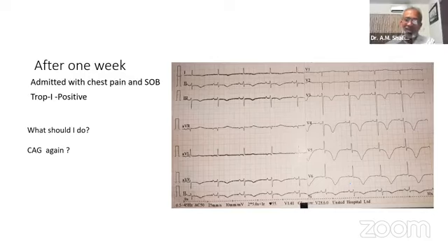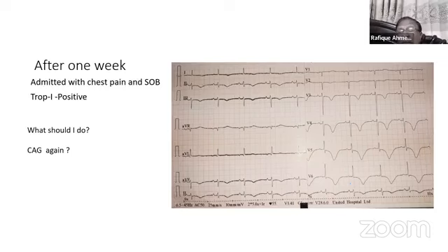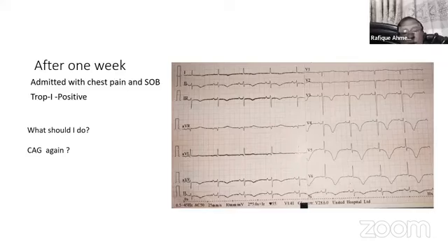So we did an angiogram again. No, let's talk about it. So what are the possibilities with this ECG? Right. One would be that, maybe the reason I asked about neurologic symptoms, the symmetric T inversion is extensive and deep. Sometimes we see it in CVA. That's one thing that I thought of. Second would be an ischemic event. But how can somebody have an ischemic event where the coronaries are normal? But one thing we have to keep in mind, the patient was in flutter. Is it possible that there is a clot there that dislodged and went into the coronary arteries?